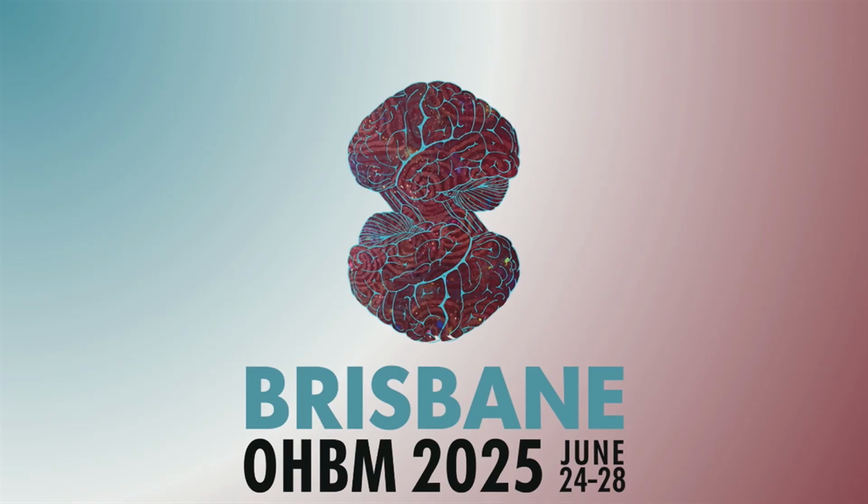Why the move to multiple slabs? Wouldn't it be more efficient to just acquire the whole 3D volume at once? So basically for a single slab, for a single whole volume, it's not easy to correct motion. So you have to do multi-slab. Also for multi-slab imaging, you can do interleaved acquisition, you can add multiband acceleration. So therefore, it's more efficient. All right. Okay, thank you. Great question.